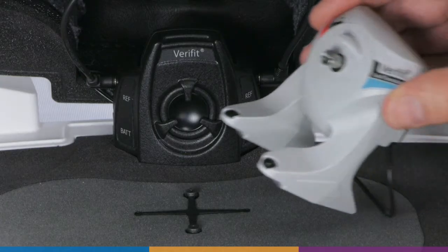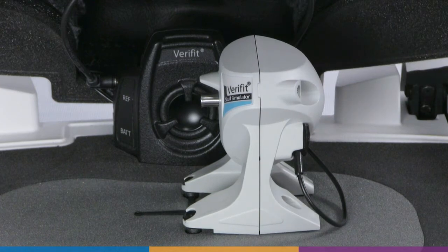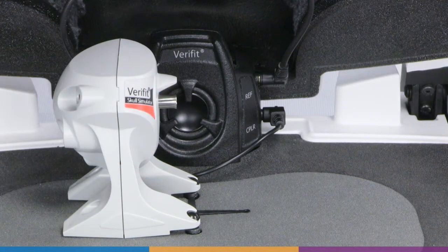For left devices, place the Skull Simulator slightly to the right of the black crossbar in the test chamber floor. The black dots on the Skull Simulator should be lined up with the black posts in the crossbar. The artificial abutment should be perpendicular to the main speaker and the blue label on the Skull Simulator facing you. For right ear devices, position the Skull Simulator similarly but to the left of the crossbar, with the red label facing you.